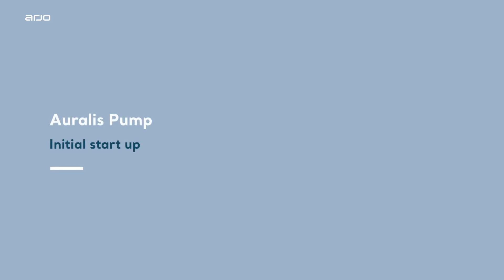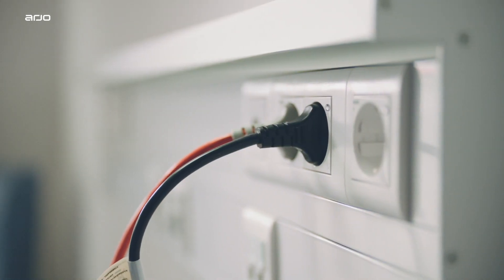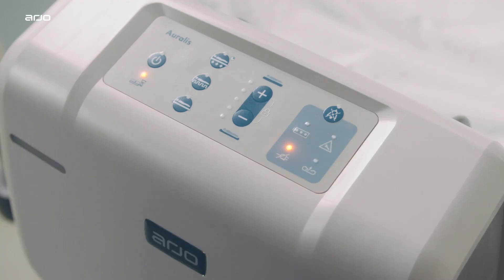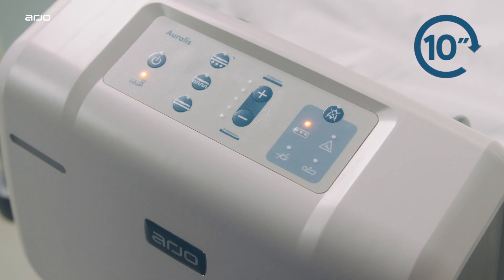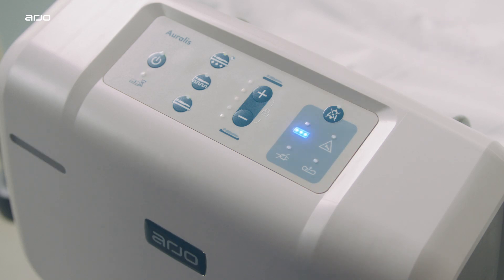Oralis pump initial startup. When the Oralis pump power cable is connected to a power source, the Oralis pump sounds with a startup tone and a self-diagnostic check runs for 10 seconds. Once the check is completed, the Oralis pump beeps twice and is ready for use.